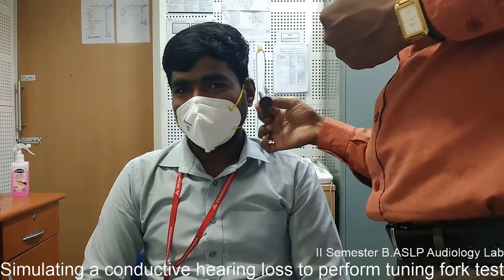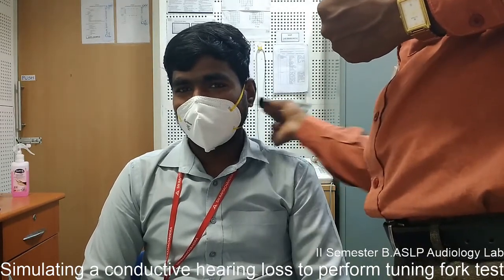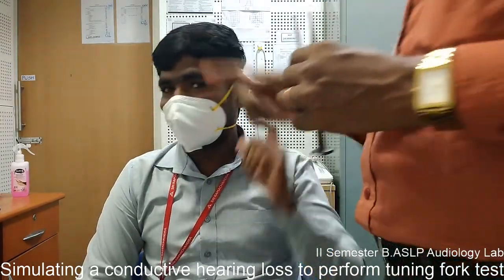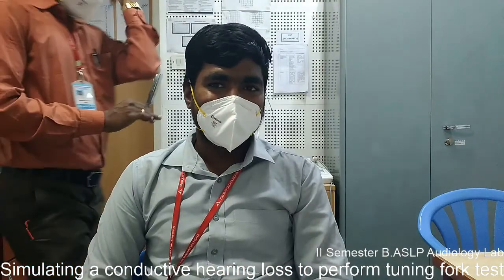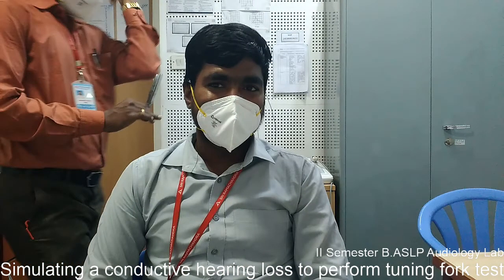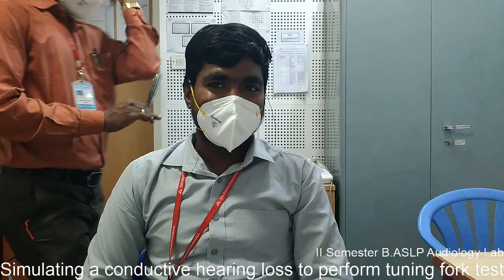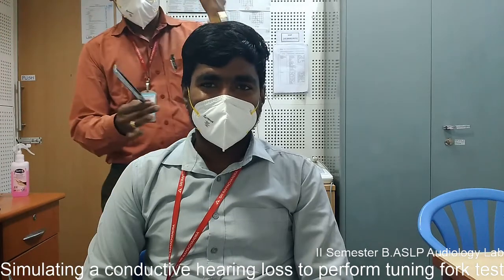The first test is the Rinne test. The tuning fork is alternatively placed on the mastoid and in front of the ear canal. The subject indicates that in the left ear he perceived the sound louder at the mastoid process, which indicates a negative Rinne.